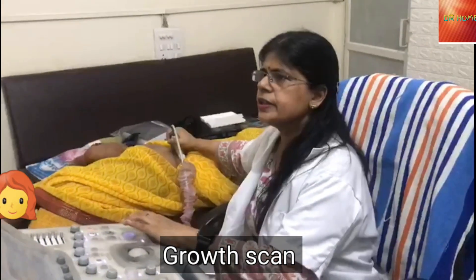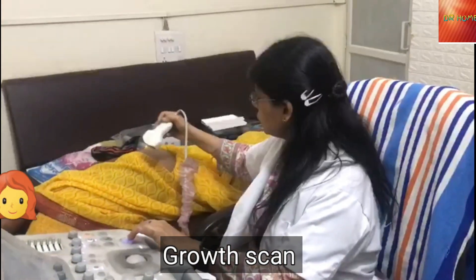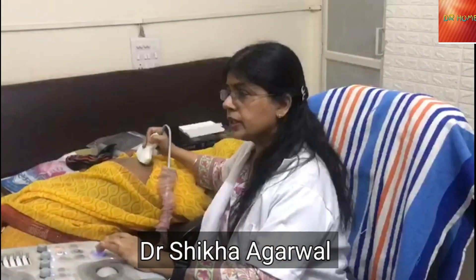My patient is Sanjana. We are doing a growth scan. First of all, we take the ultrasound machine probe and we put it on the tummy.